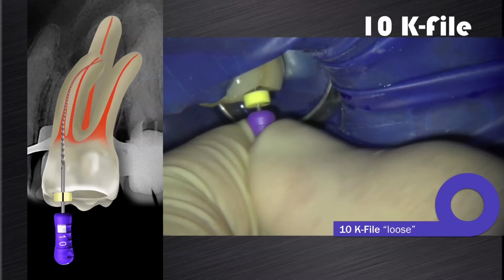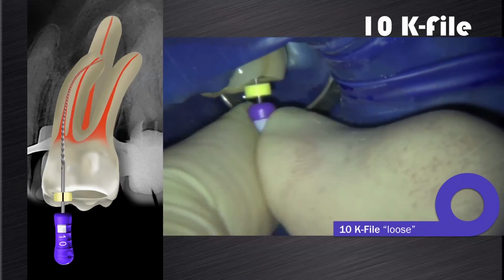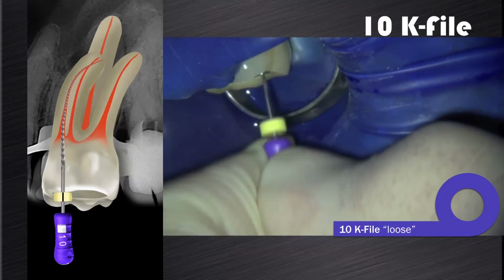In these types of canals with an irregular glide path, it is advocated to take an 08 or 10K file to full working length, and then using small amplitudes, we have to make the file loose at 1mm, then up to 2mm, 3mm and 4mm from working length, according to the technique described by John West.